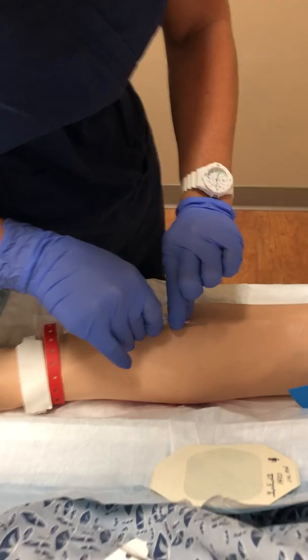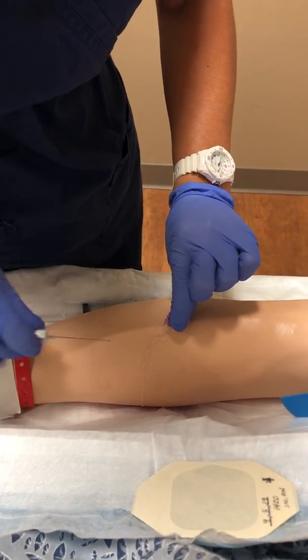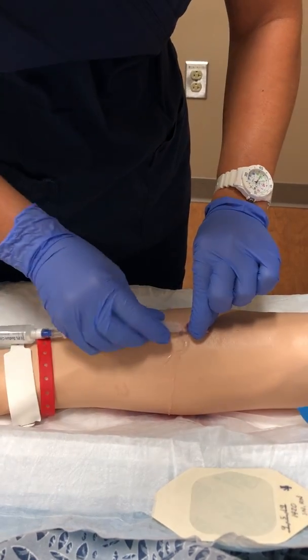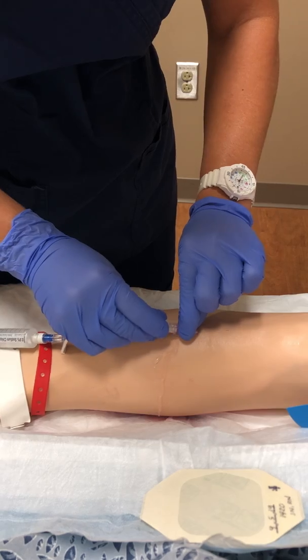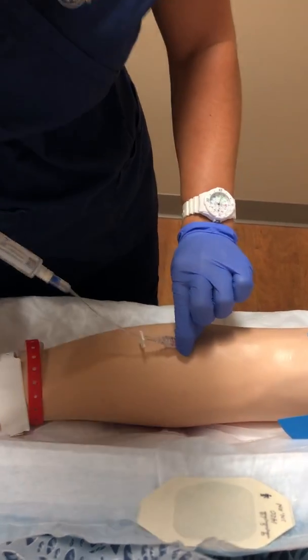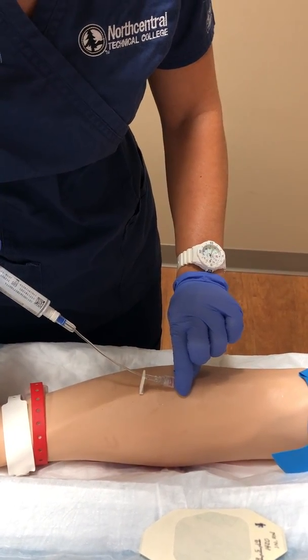I'm going to grab my catheter. I'm going to retract my needle. Remove the cap. Fasten that. Just going to flush it. Appears to be flushing quite nicely.